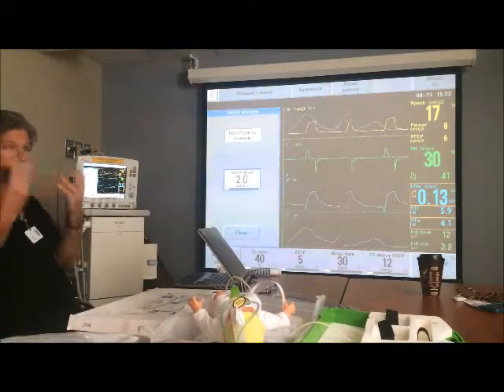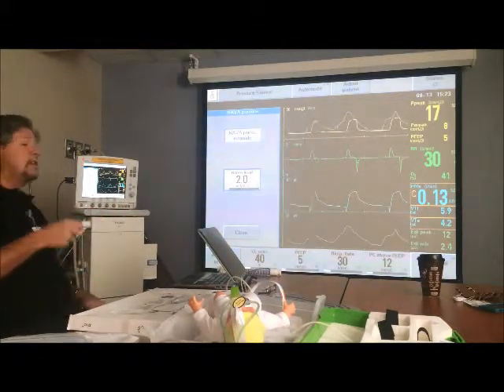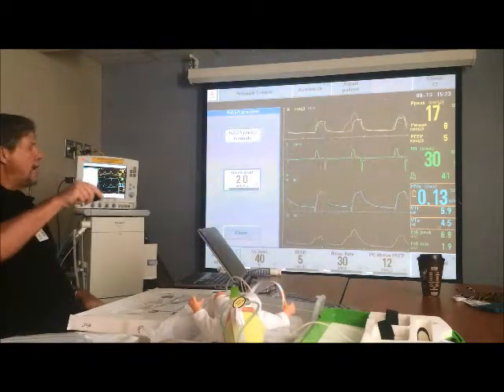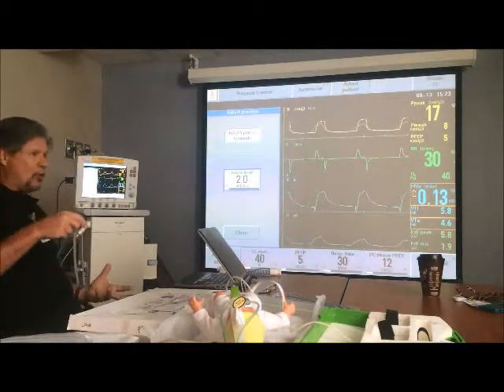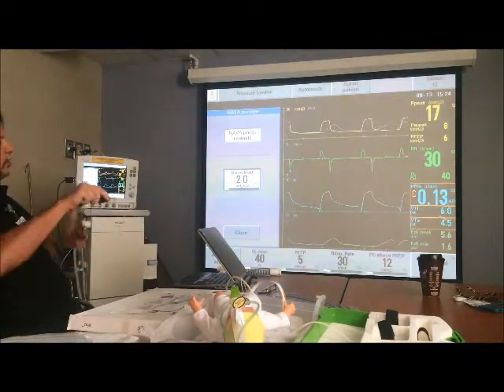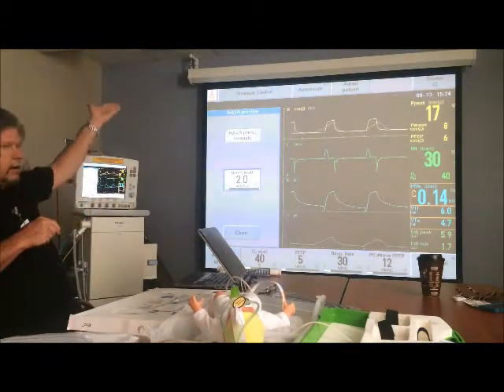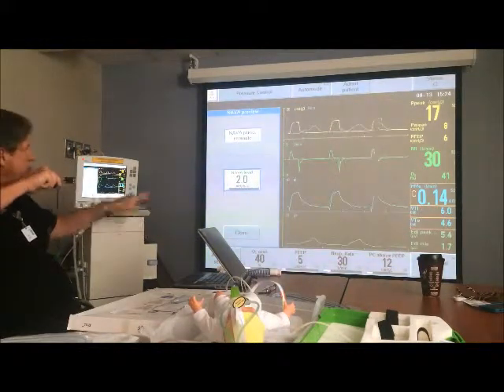But he's still going to maintain his life, right? He's still going to maintain volume, so he's going to adjust this number against the amount of support that we're giving to always maintain the tidal volume. So this is where NAVA is really cool, because you give control up to the baby, and the baby then will determine what number this will be against this. So if we increase this number, the patient will lower this number, because we're giving more.